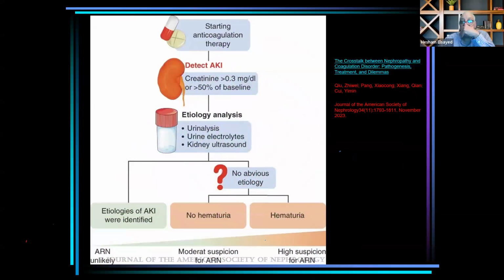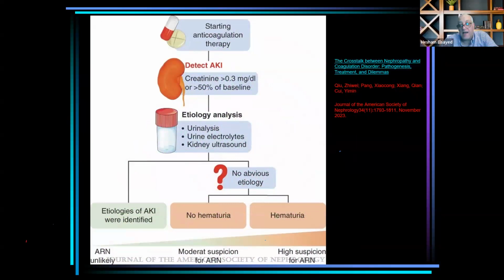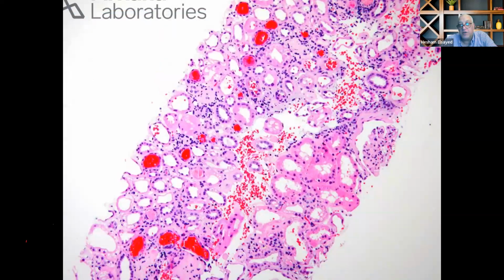I can intervene for a second, if you allow me, Professor Hassan. Yes. If you go back one slide, you can find, as you perfectly described, the entity. We are still talking about hemoglobinuria and the precipitation in the renal tubule. The cast takes the shape of the tubule, or the cast may have a significant shape inside the tubule.